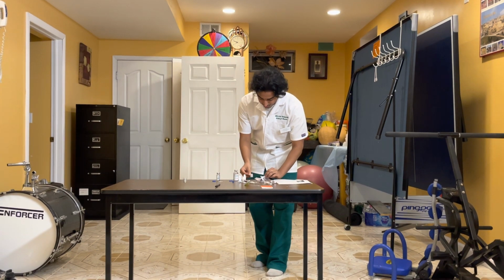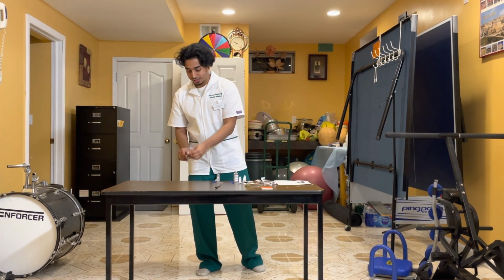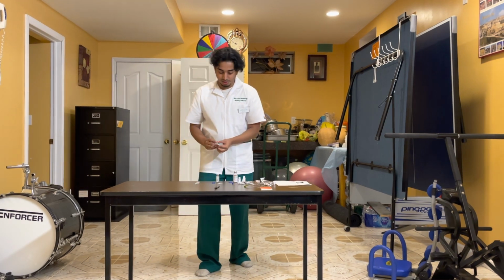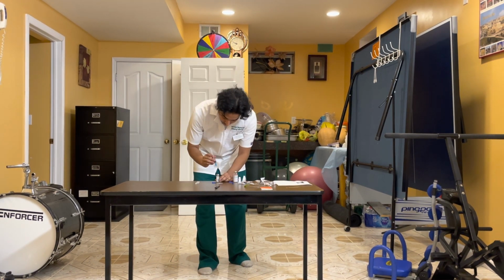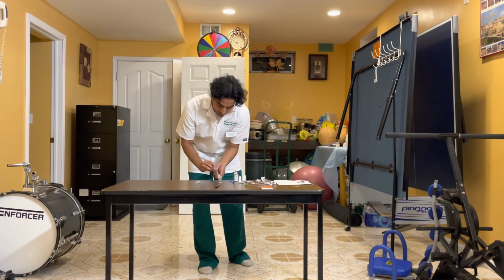Okay, now that it is clean, I take out my syringe, and I pull out the vancomycin, 6 milliliters.